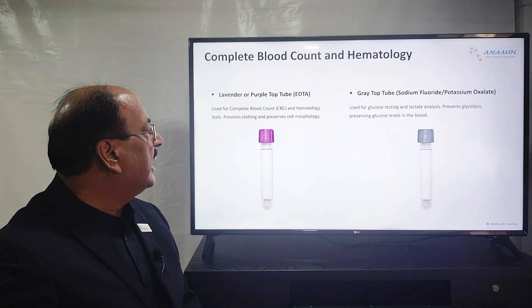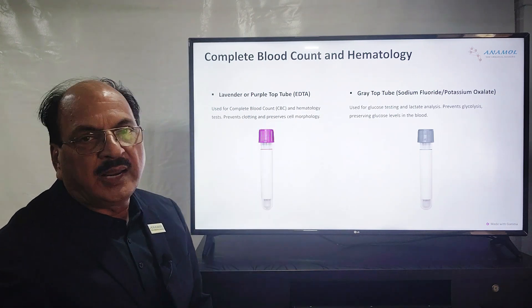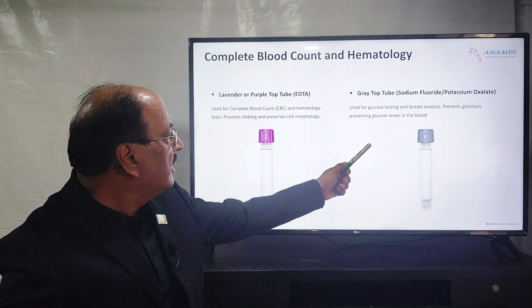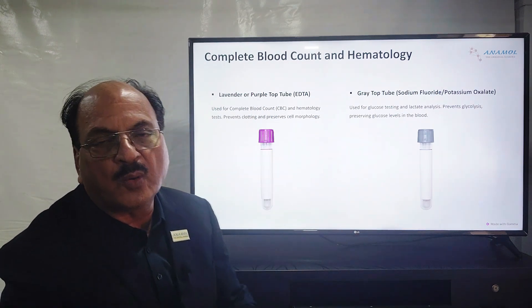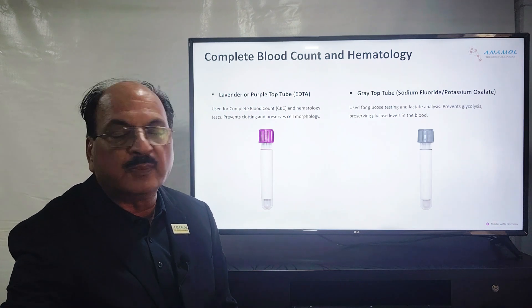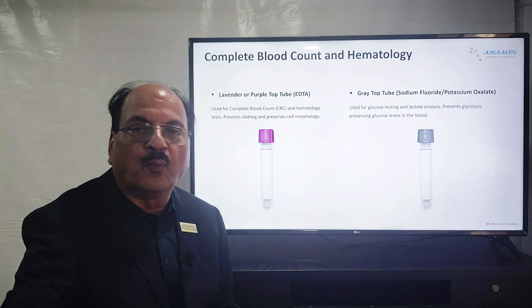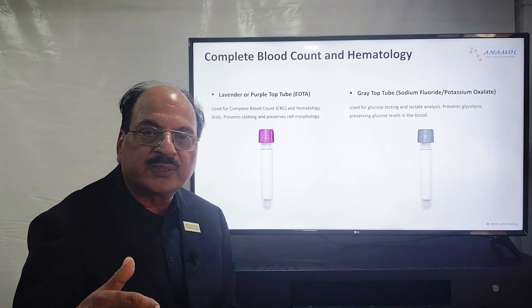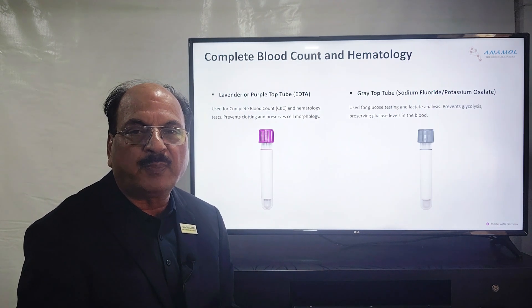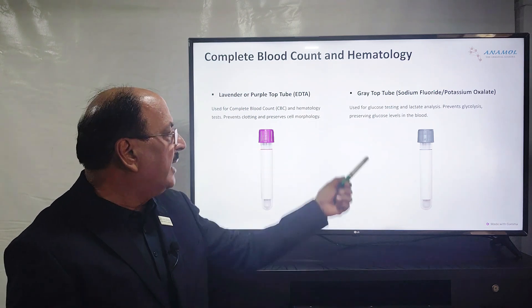Here we have two more colors: lavender and gray. Lavender is a simple EDTA tube, and gray contains sodium fluoride and potassium oxalate. The lavender EDTA tube is used for plasma separation without clotting. Plasma is preferred because serum separation normally takes a longer time for clotting to happen, whereas plasma is quickly available for testing. So EDTA tubes, which are lavender in color, are preferred many times.